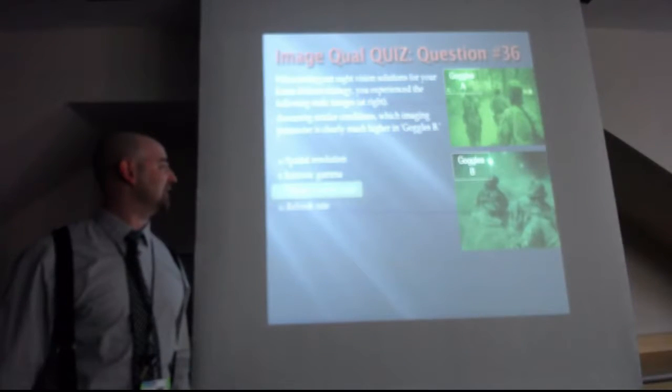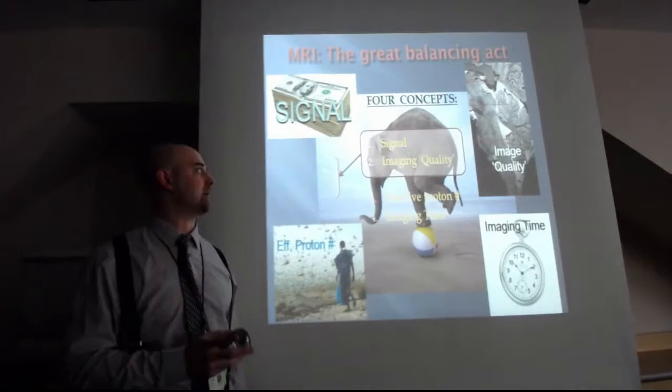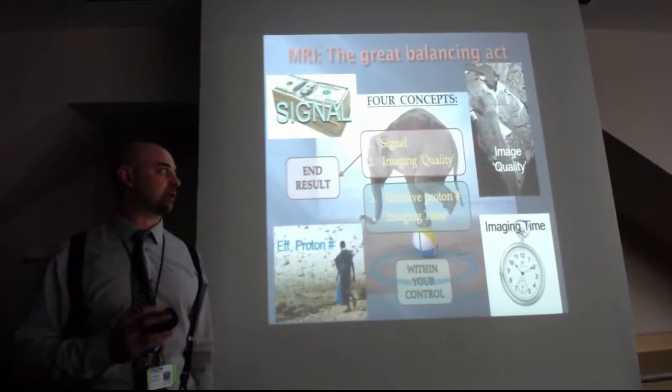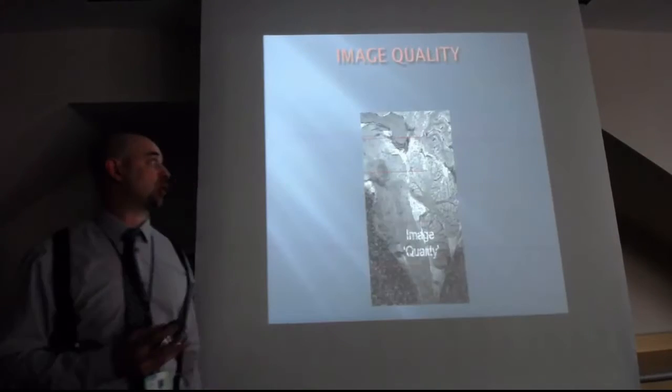It is the signal-to-noise ratio. And we're going to talk about that difference here right now. That's just your basic introduction to signal. Let's talk about what quote-unquote imaging quality means.